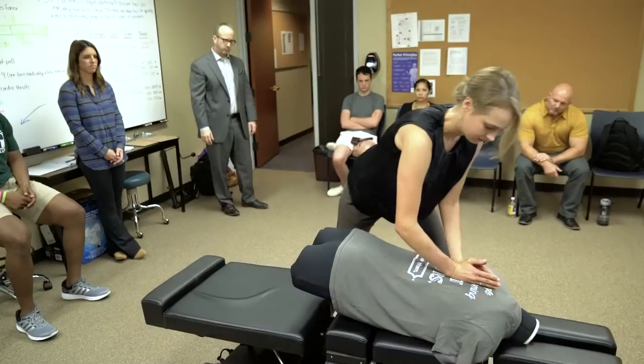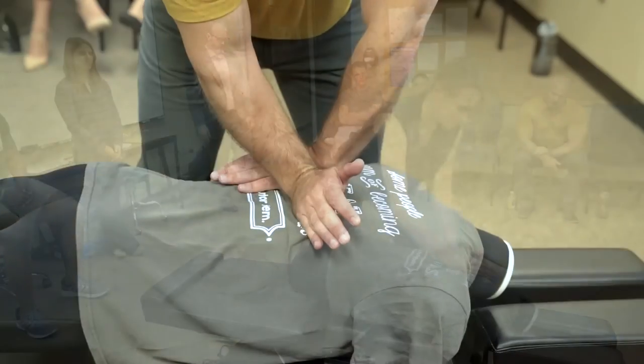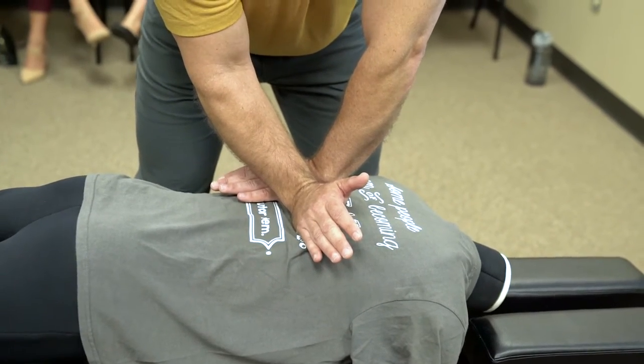My name is Dr. Eric Russell. I'm the Department Chair of Chiropractic Sciences at Parker University, and this is the Force Sensing Table. It is something new and revolutionary to chiropractic education. It's a table that gives students feedback on how to deliver an adjustment so they are repeatable, and they know how to deliver forces and change those forces for maximal clinical outputs.